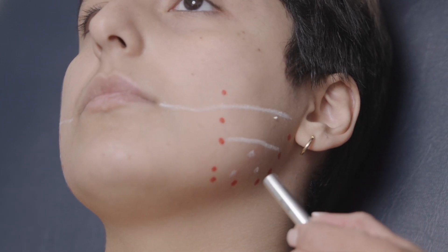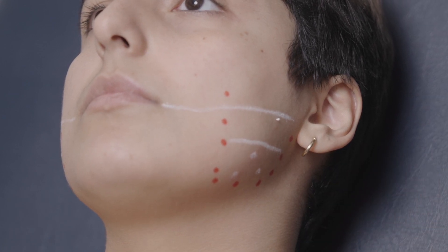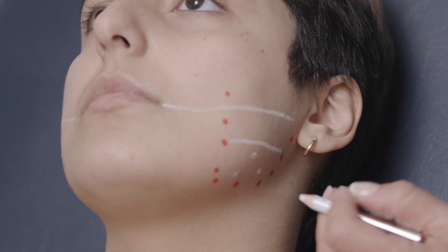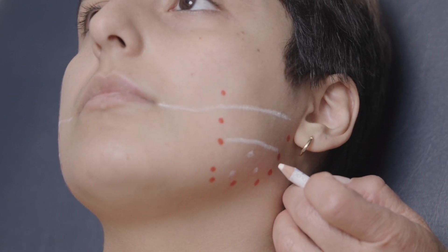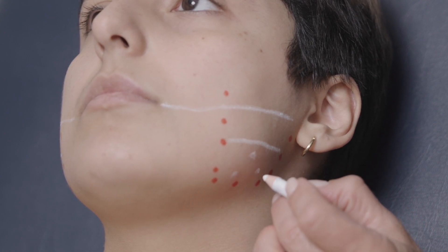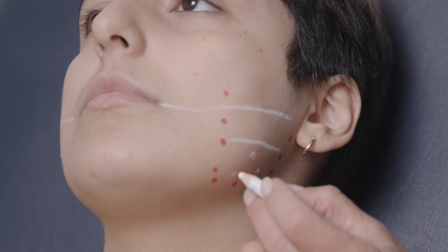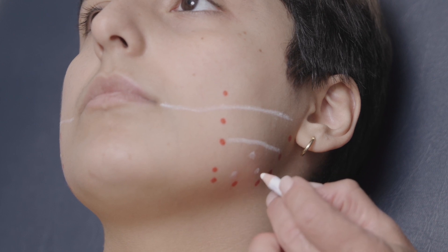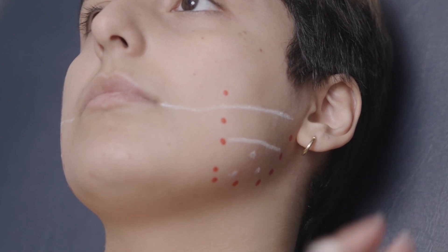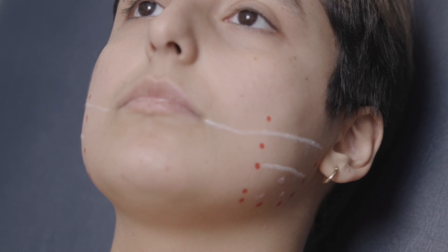I'll be injecting the right side with 40 units of onabotulinum toxin and on the left hand side 35 units of onabotulinum toxin. My approach will be from posterior, single entry, dividing the doses — 35 units divided by three in each of the bellies, and 40 units divided by three in each of the bellies on the right hand side.